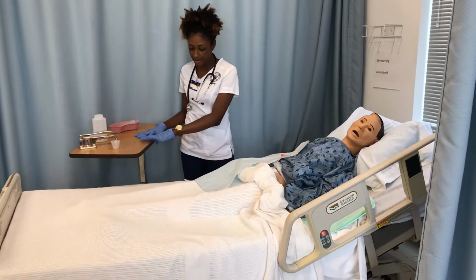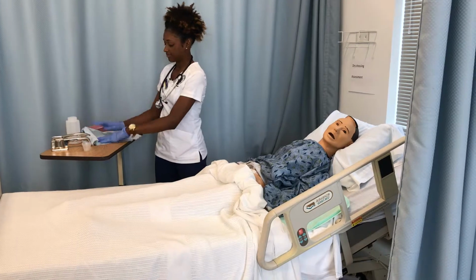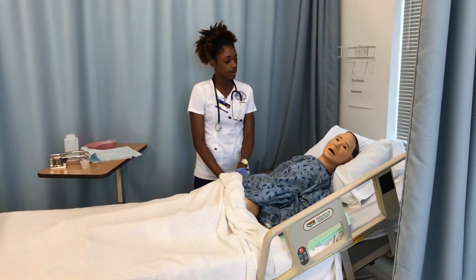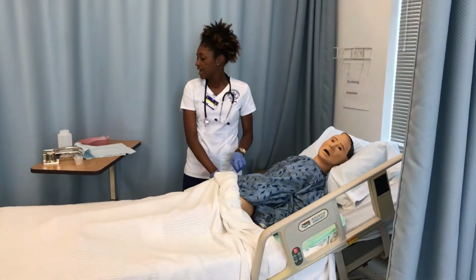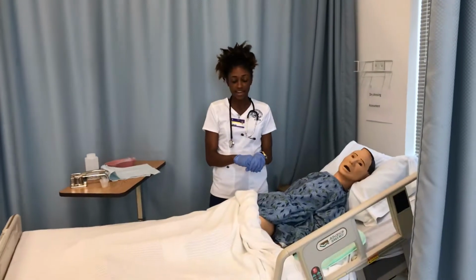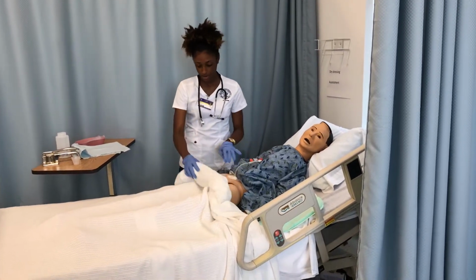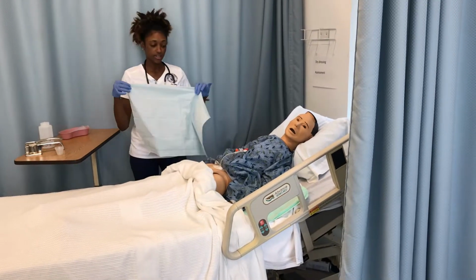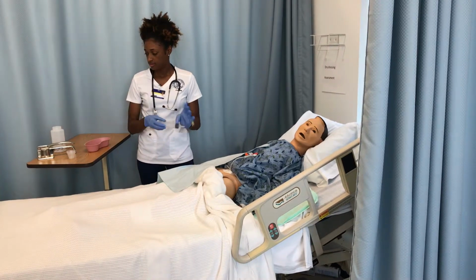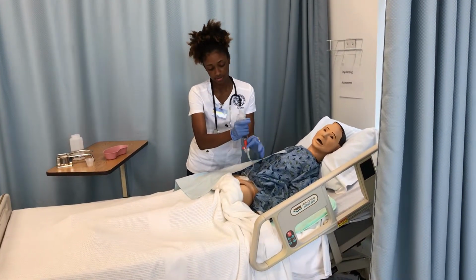So I would come back and check my patient's ID, 2 forms, and then I raise the bed. I'll go ahead and auscultate the abdomen again, and then I'll check for placement. So that part I'll do over. So I'll place the chuck back down again. Insert my syringe.